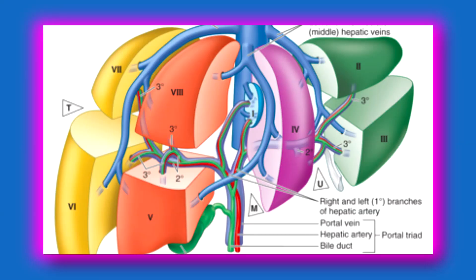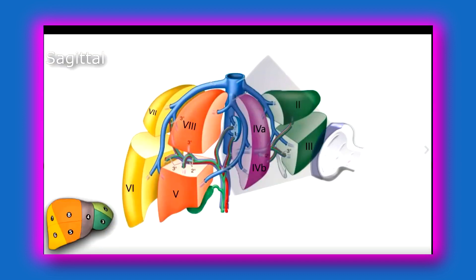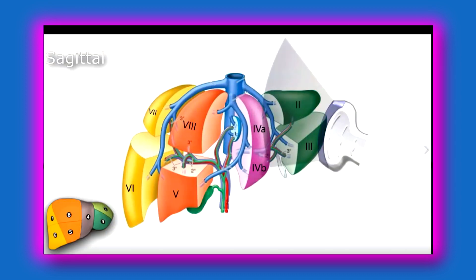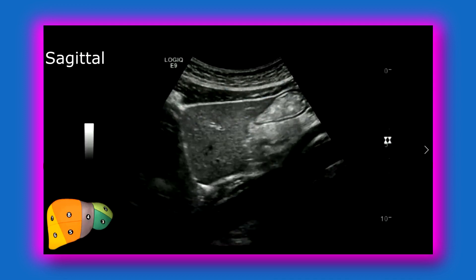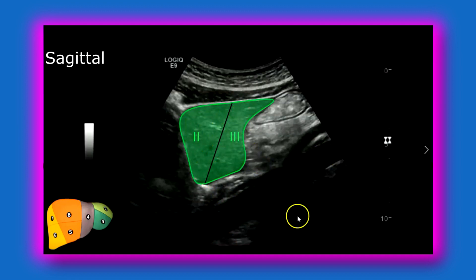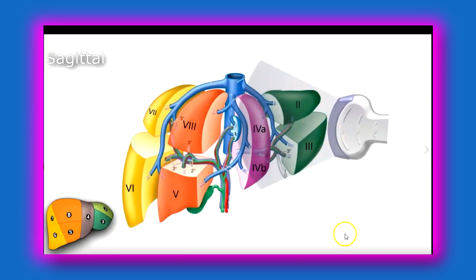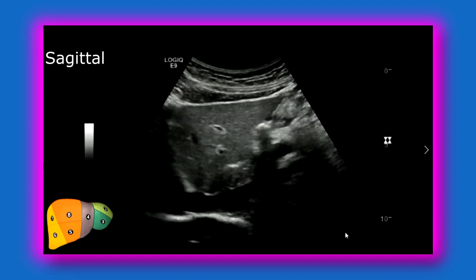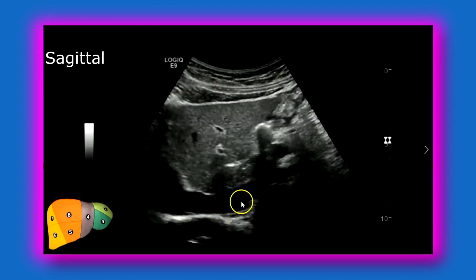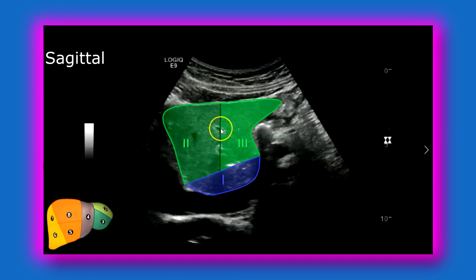Now let's look at some ultrasound views beginning with sagittal. You've got your probe there on segments 2 and 3. Here you have your aorta, with superior segment 2 and inferior segment 3 in sagittal. Moving more laterally, you have your IVC, segment 1, and again segment 3 and segment 2.